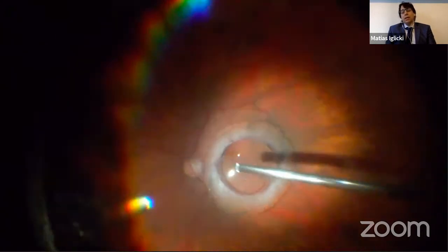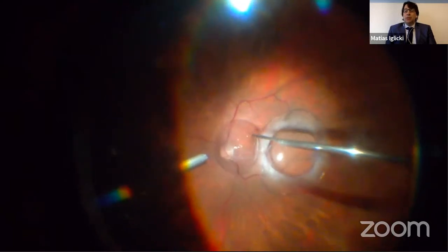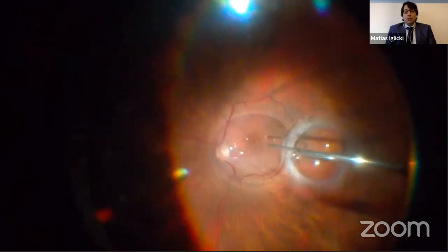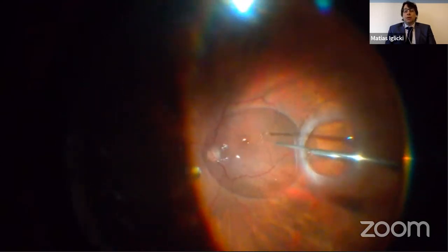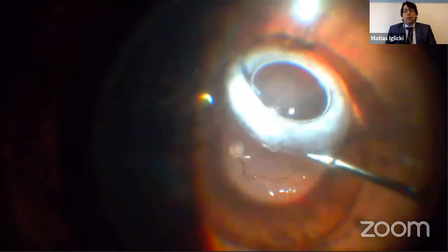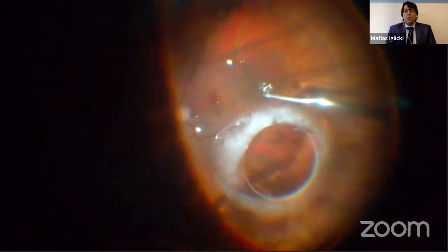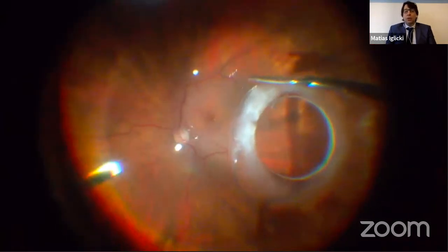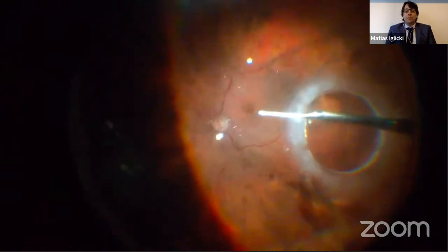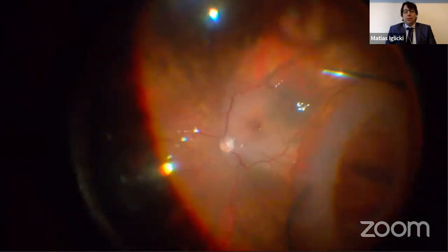It is the whole intraocular lens and the capsular bag inside the eye. Of course, we perform the vitrectomy. It's very important to say here that the vitrectomy is key in this technique in order to avoid complications. So Dr. Zur will talk about some complications, and let me give you a sneak peek: the complications are less with these needles. But in order to avoid retinal detachments, retinal tractions, and retinal tears, we have to perform a vitrectomy. That is why we strongly recommend that the anterior segment team work very closely with the vitrectomy team.